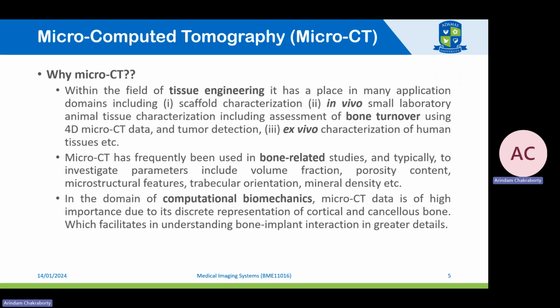So in vivo tissue characterization of small laboratory animals without sacrificing them for a longer period of time can provide useful information which was otherwise difficult to get using conventional CT. Also, ex vivo characterization of human tissues can also be performed.